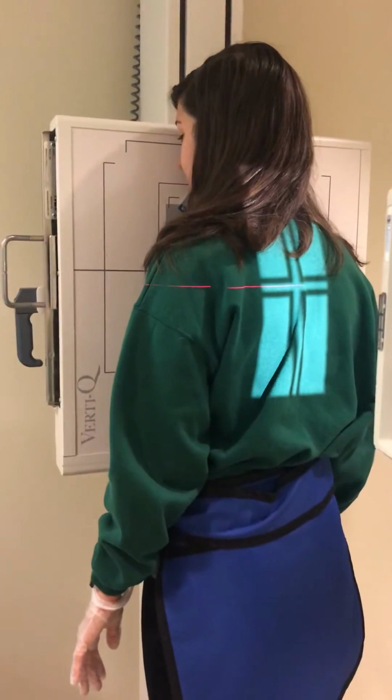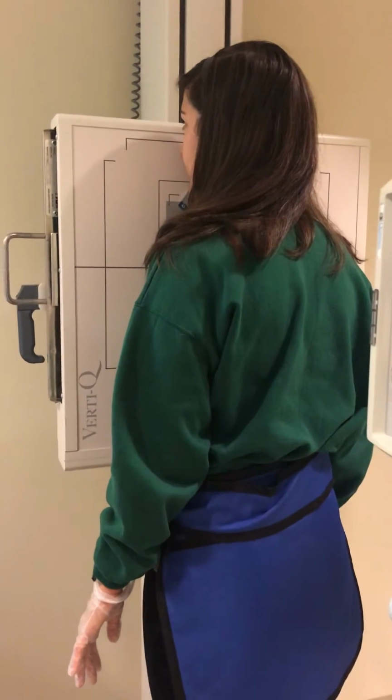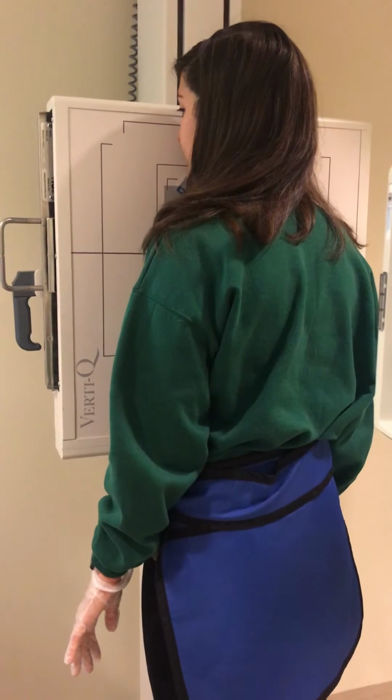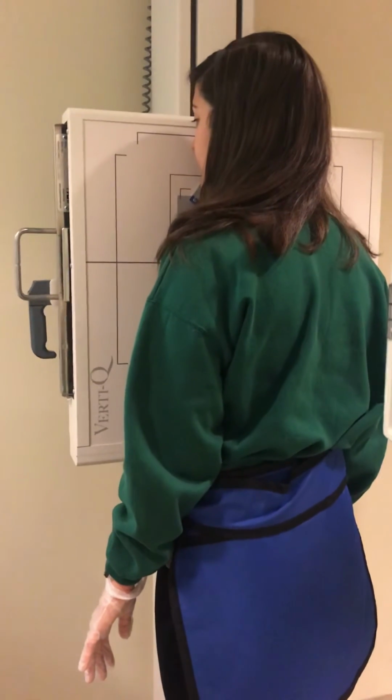Now with this one, we're going to do a breathing or orthostatic technique, which means the patient's going to be quietly breathing during the exposure. We want a minimum of 2 seconds, ideally 3 to 4 seconds as we're making that exposure. And that helps to blur out the ribs.